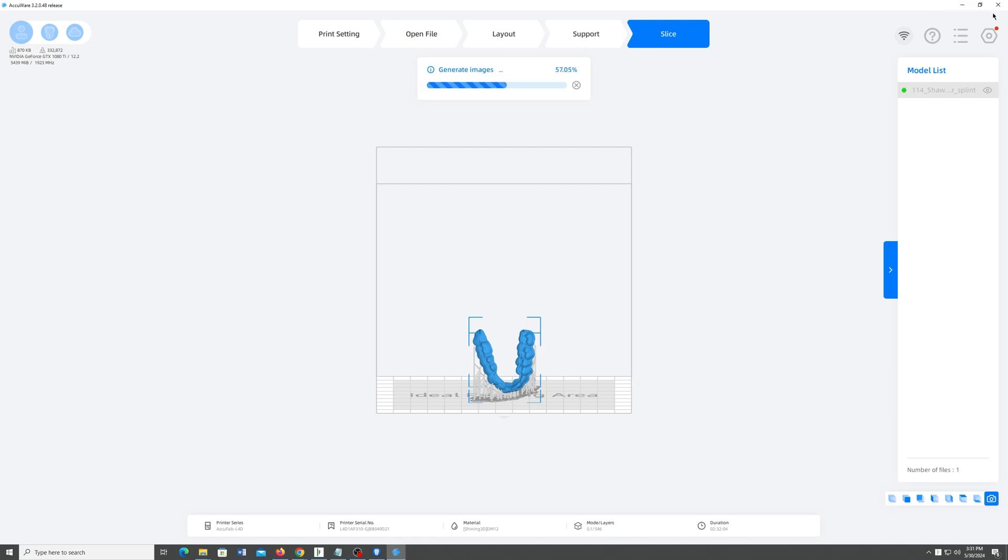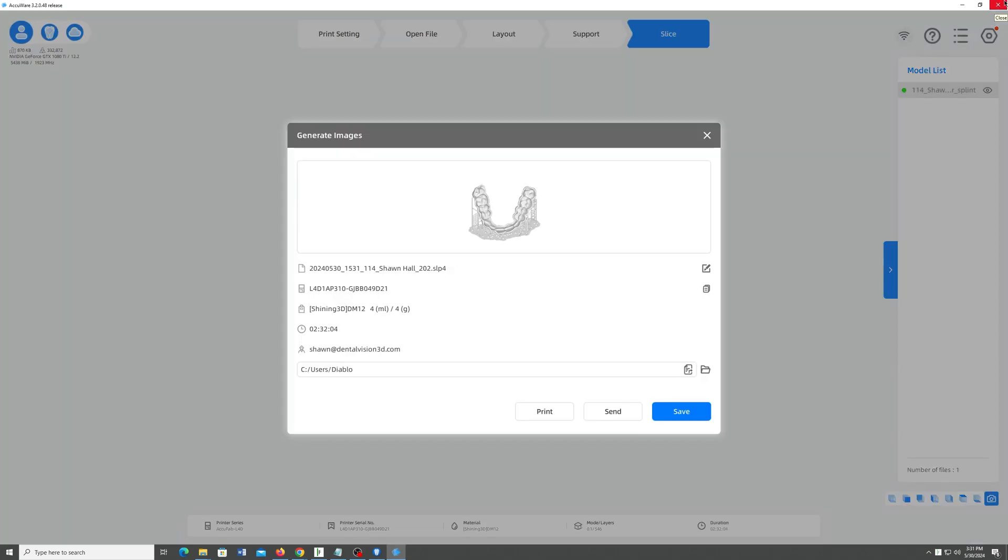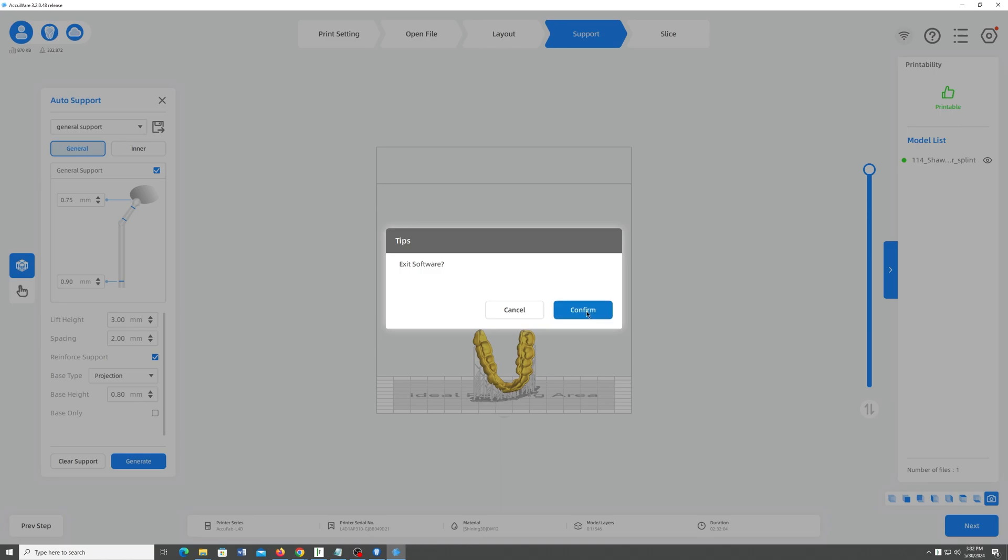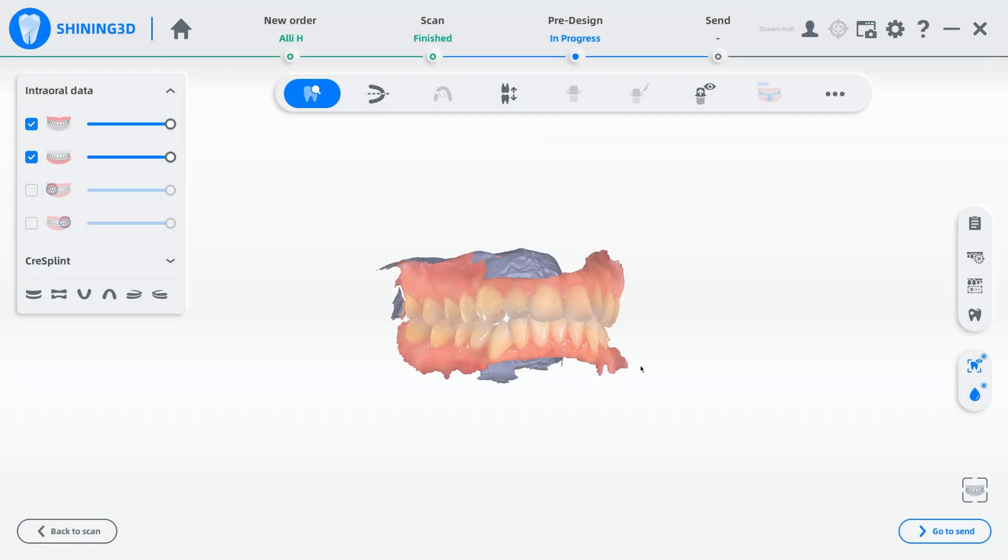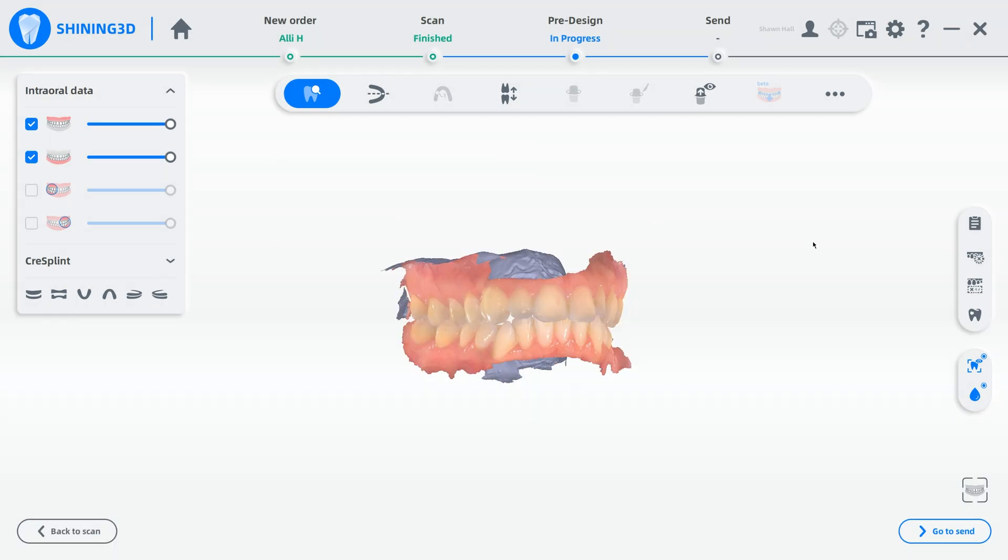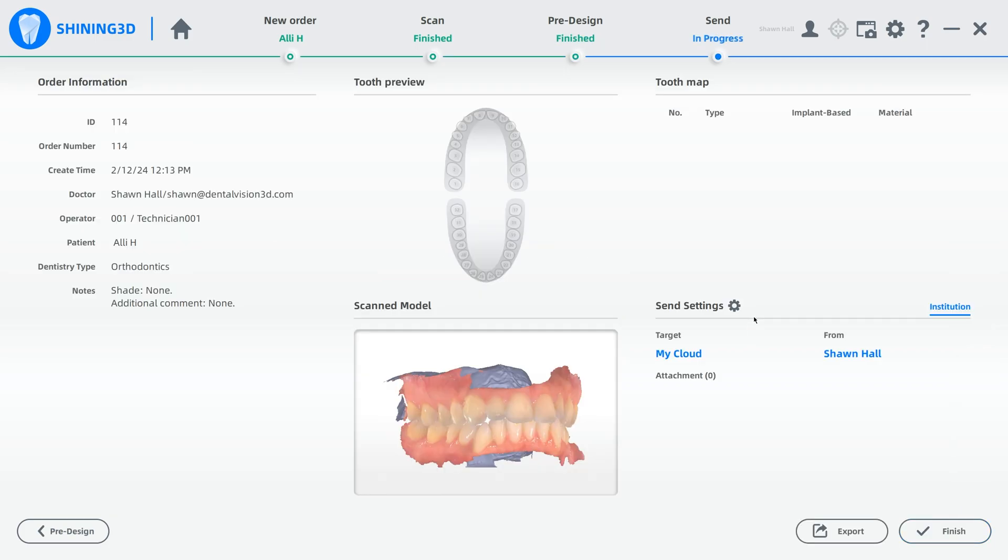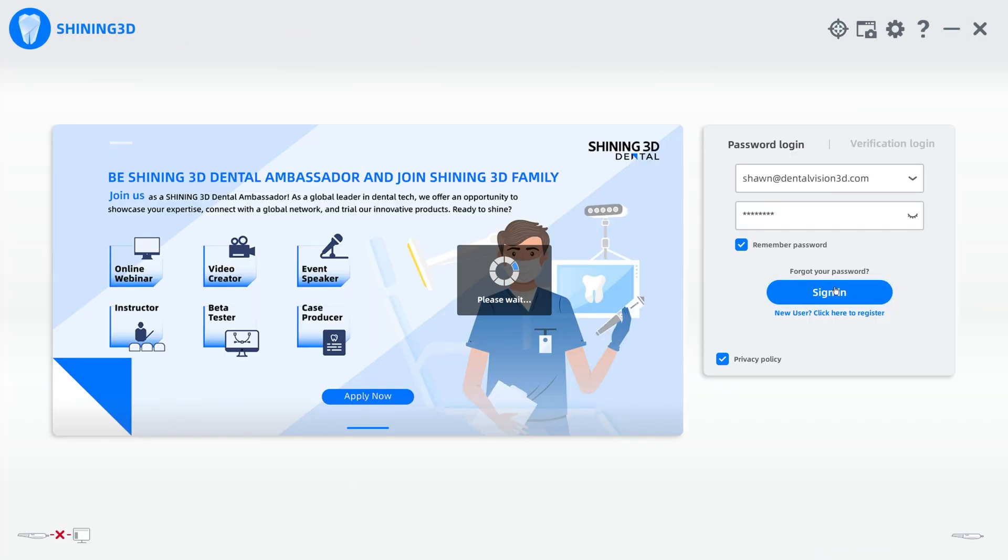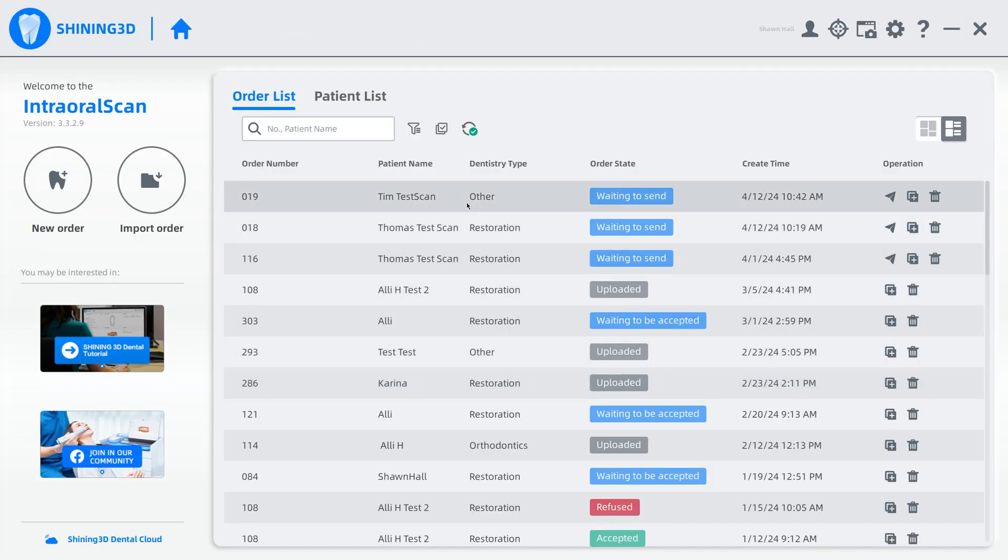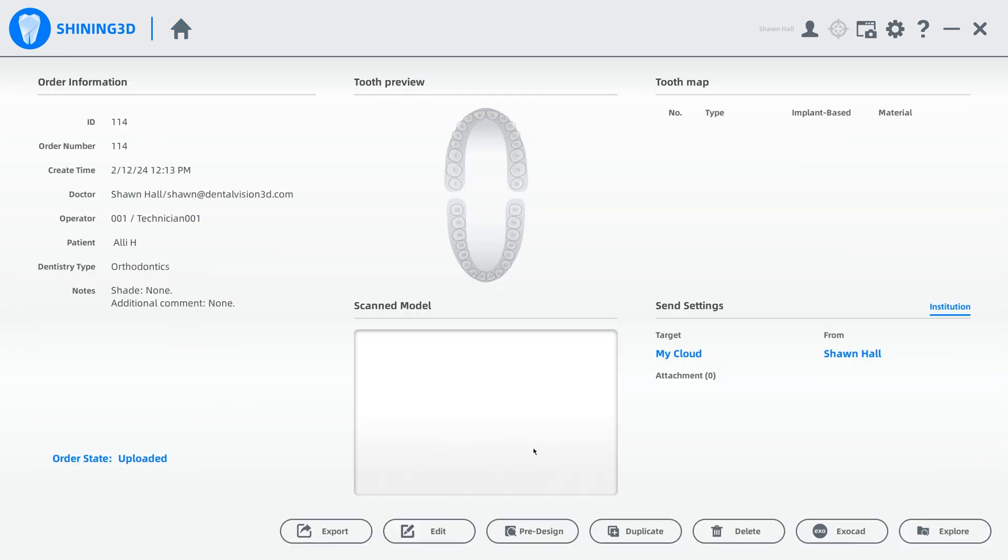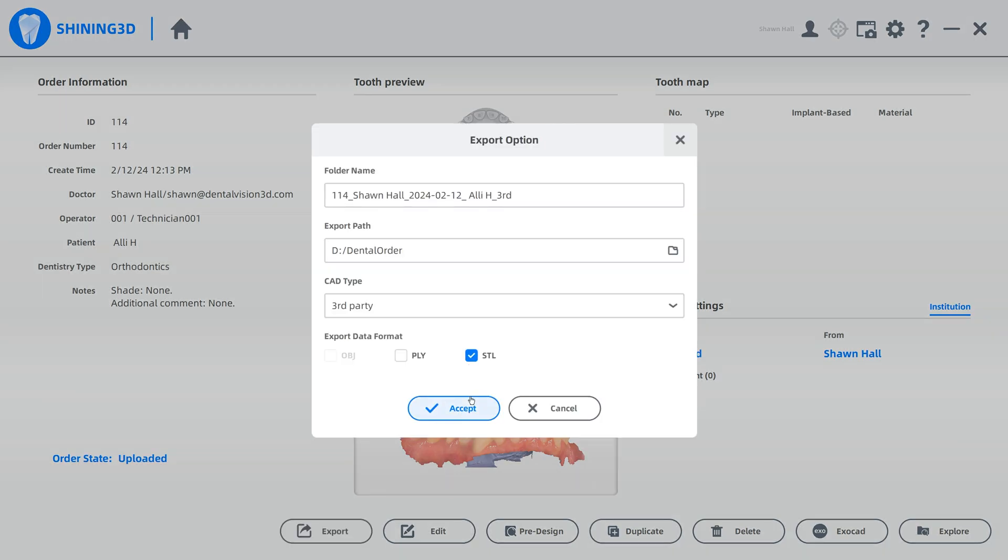Now, let's say you wanted to send that bite splint out to your printer. But for whatever reason, you didn't put the AccuWear software on the same computer as your scanner. What we can do here is actually, we're going to go back to scan. Oh, no. Don't do that. Don't go back to scan. We are going to go to send first. I'm going to re-log in because apparently my login expired. And then I'll just reopen that patient I was in, which was this AliH Orthodontics. I can actually export. And when I export, it'll also export the bite splint model. I'll show you that.